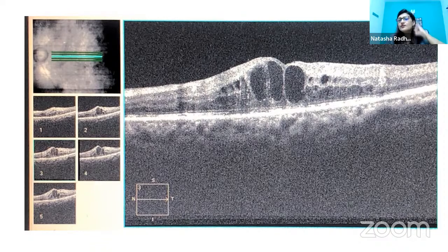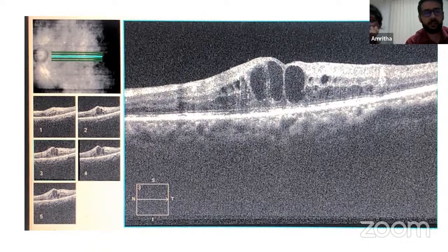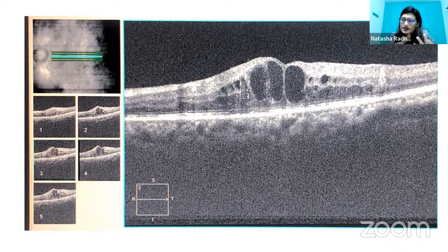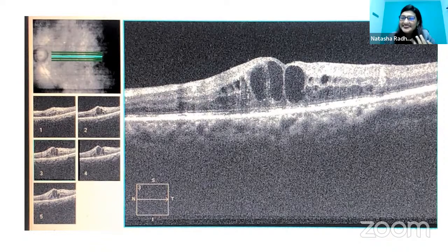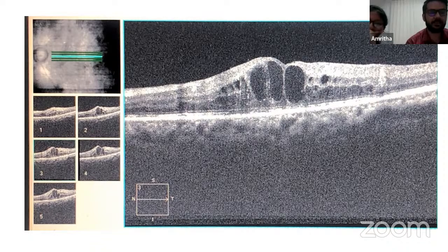Okay. No, just tell us all the causes of cystoid macular edema. Again, like epiretinal membrane, how can you classify it? Okay, then degenerative causes would include retinitis pigmentosa. Was that the most common cause? Do you want to put that first? No, because while discussing that time, we included that classification, so that stuck into my head. I put it much lower down. Yes, so it's not at the top of the list, but yeah.